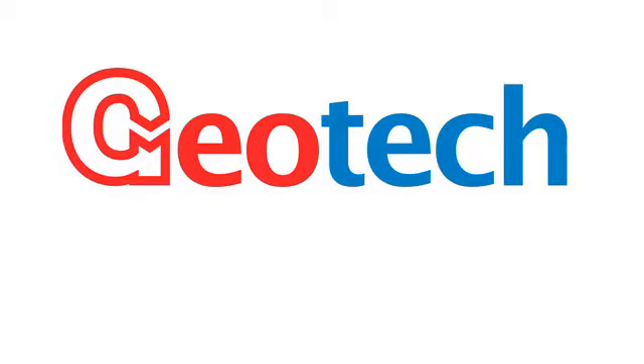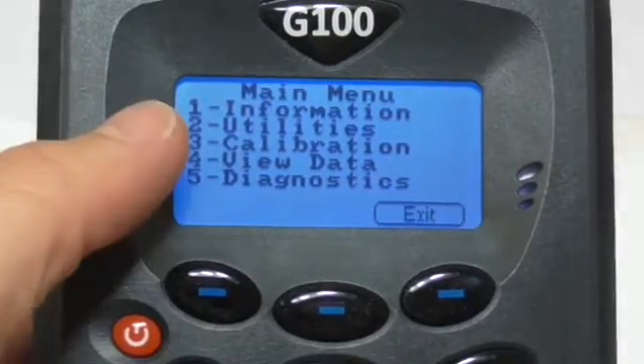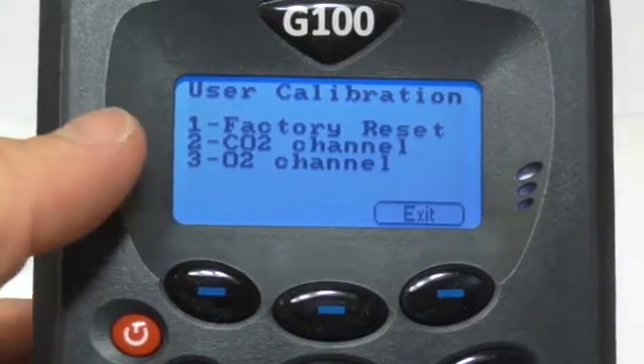This video demonstrates how to calibrate a G100 instrument. Once the unit has been powered on, press the menu key, 3 for calibration, followed by 2 for the CO2 channel.